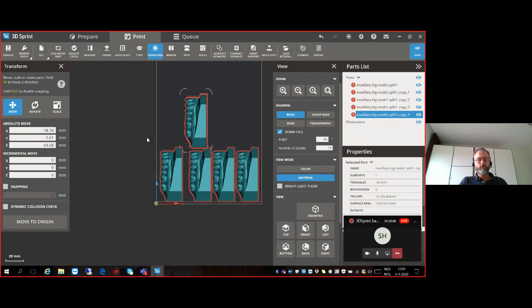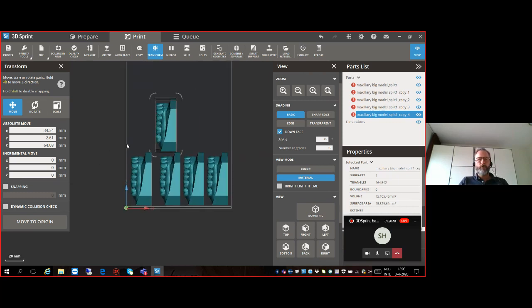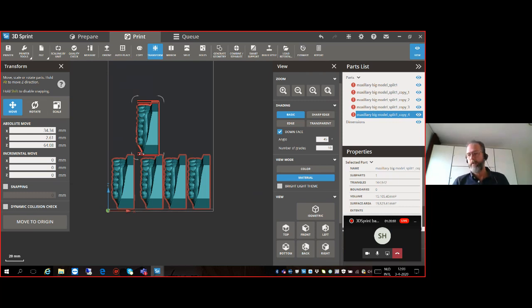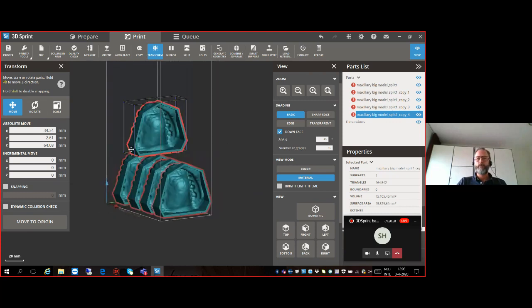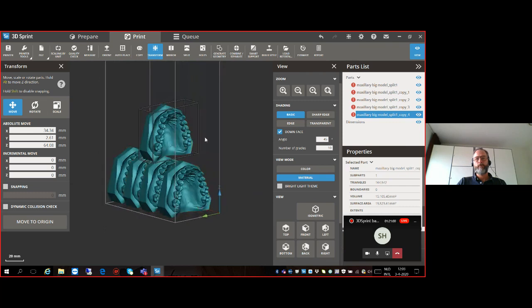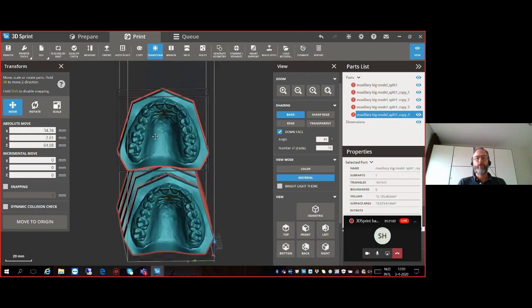Yeah, the maximum so far, I believe, is 40 models. So 40 models already. Okay. Yeah, the smaller they are, the more you can fit, of course. And the print time for a full volume of printing will be approximately 2 hours. So that's very exciting. We're looking forward to handing this over to the broader market.